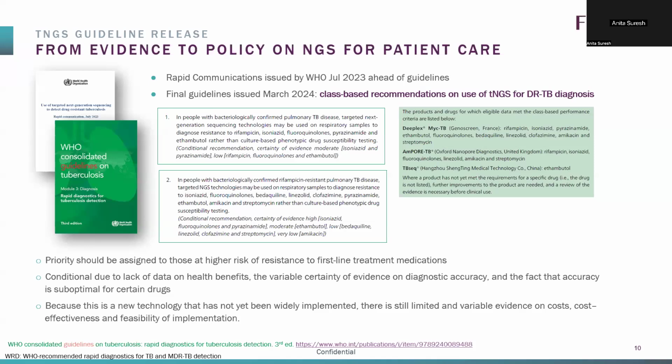We don't want more resistance to these new drugs, but over time, unfortunately, resistance will emerge. So we want to make sure that a technology like this can keep up, that we can quickly update as knowledge improves on mutations associated with resistance, link them back to an assay, and get the test to actually report on these mutations as well.